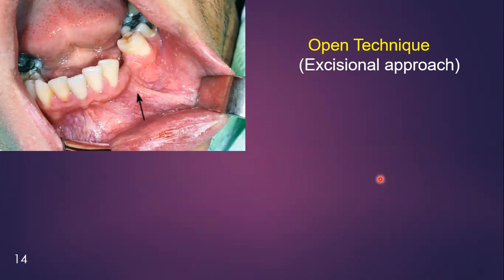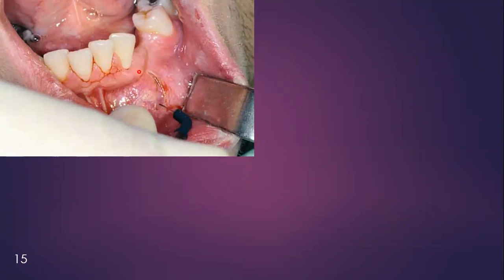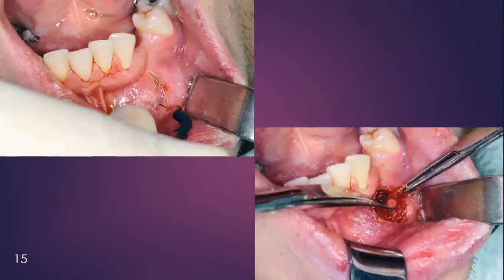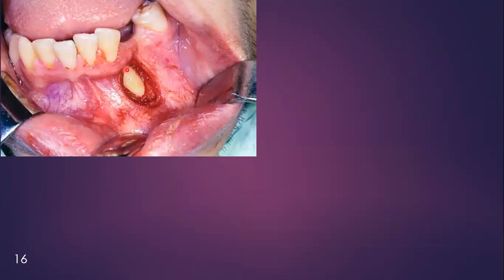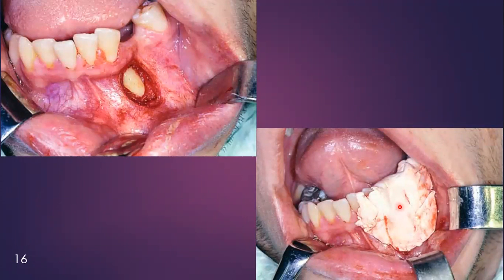Here you can see a clinical example of an impacted mandibular canine showing a vertical impaction. The tissue has been excised with the help of a curette and the crown has been fully exposed. You can now place a bracket over the exposed crown, or the orthodontist may place the bracket later. A dressing has been applied for the time being.